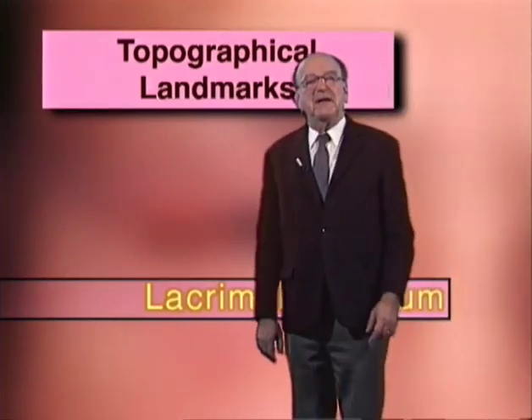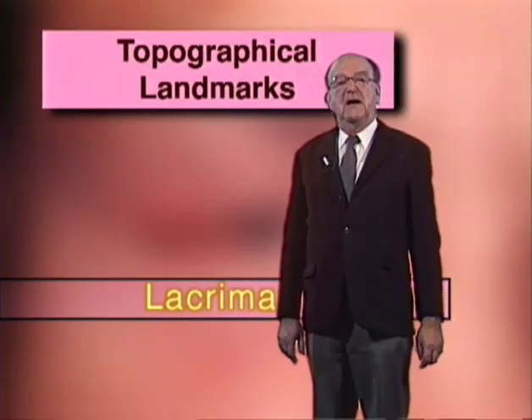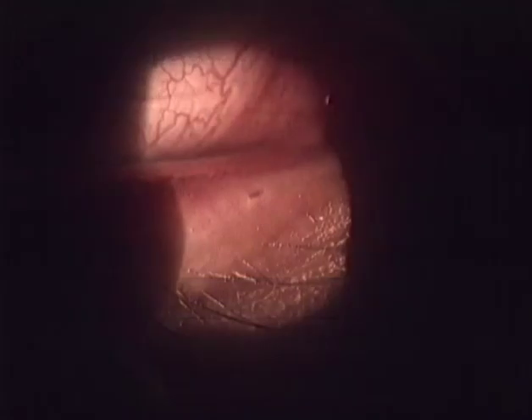Slit lamp examination of the lacrimal punctum can help in the diagnosis of obstructions at the orifice proper or in the downstream pathways. The normal punctum is situated within the conjunctival part of the lid margin and thus surrounded by conjunctival epithelium. The orifice is lined by translucent epithelium with a sharp delineation, both internally and externally.